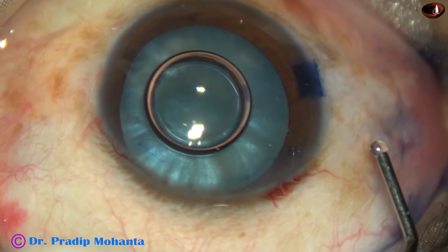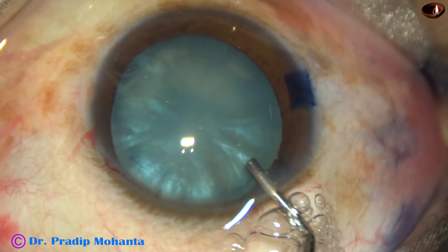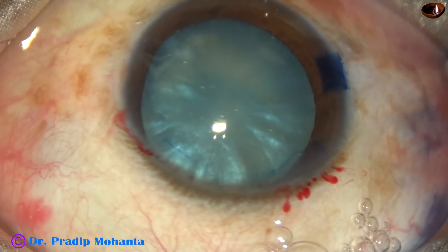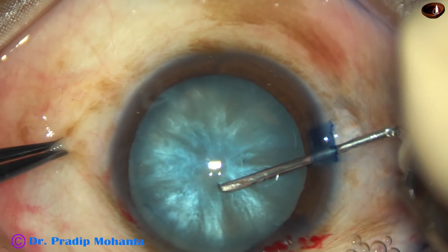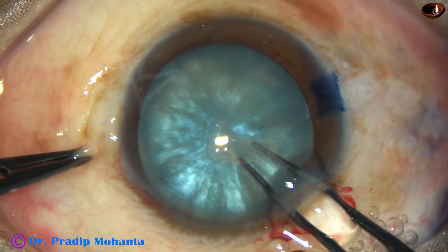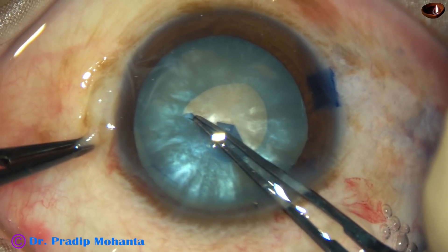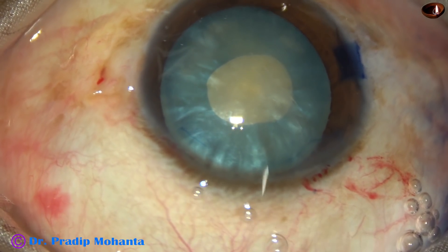Here it is — this is 2% HPMC. The reason I use 2% HPMC is I practice in an area where people cannot afford much. I found out this way of doing rexis: I just make a flap on the anterior capsule. It is a C-flap, and I convert this C-flap with a utrata forceps into a mini-rexis, a small rexis.